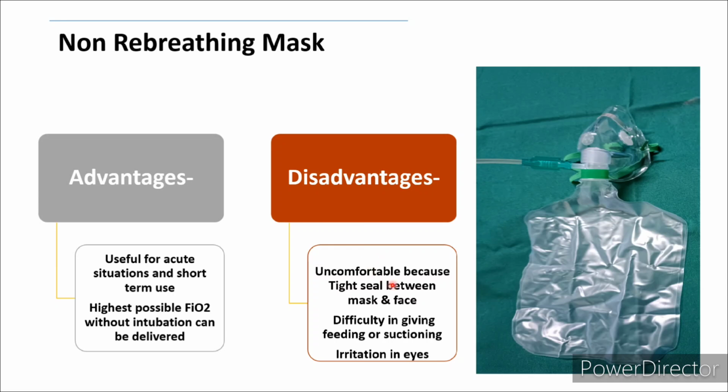Disadvantages: it is uncomfortable because a tight seal is required between the mask and the face. There is difficulty in giving feeding and suction, and irritation in the eyes can occur because of NRM.